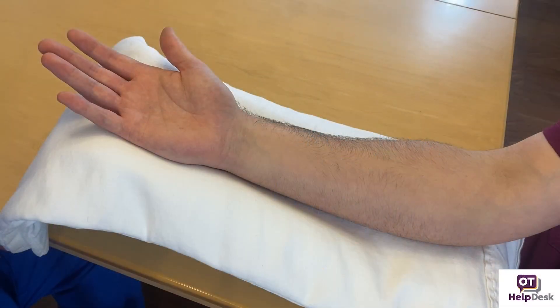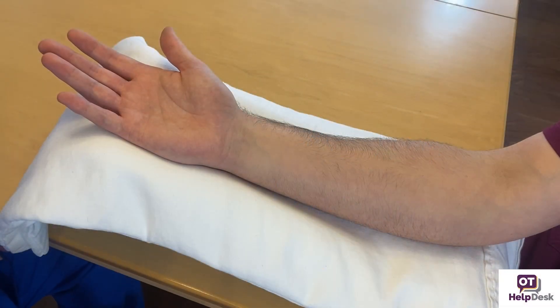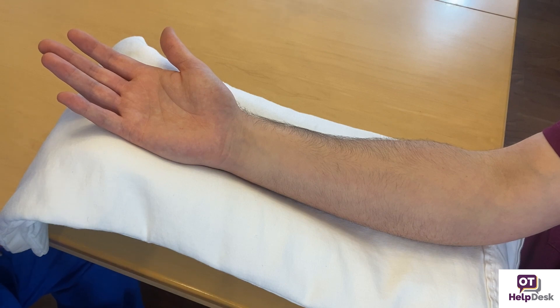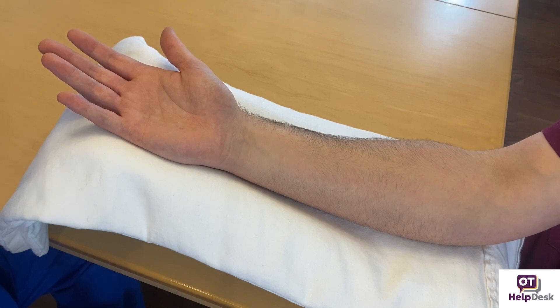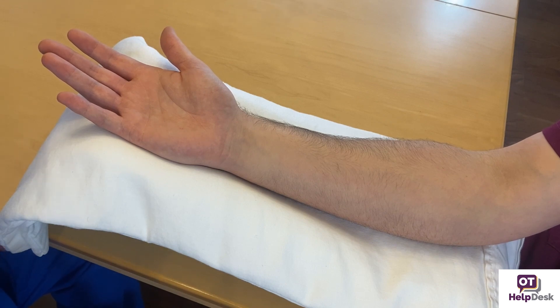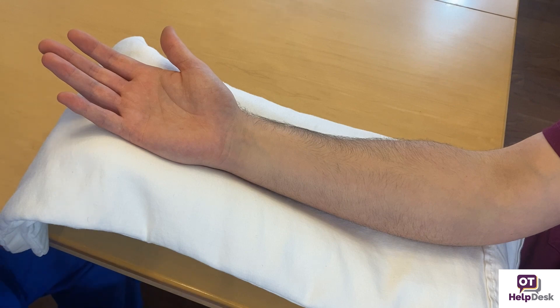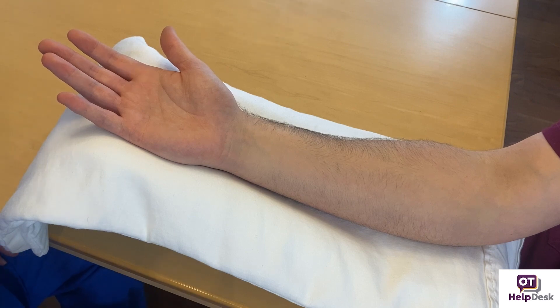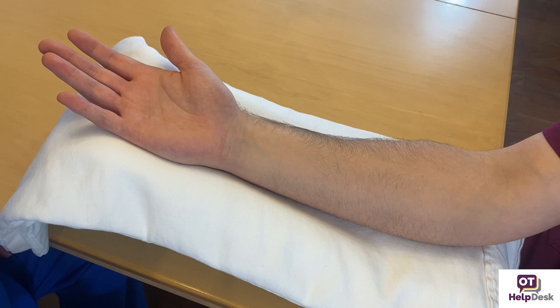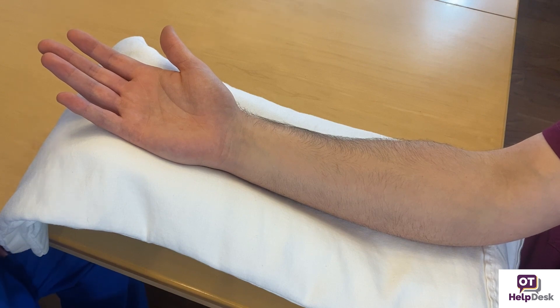We're going to test for touch sensation. We can do two things: we can use either two-point discrimination, or we can use the monofilaments — which we all know as the Semmes-Weinstein monofilaments.